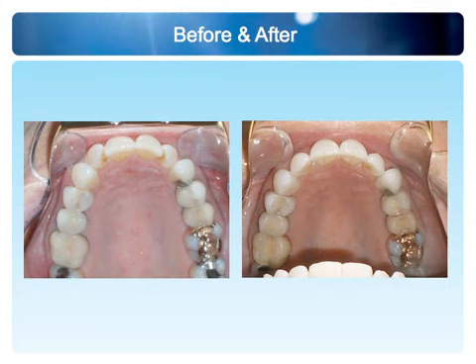The alveolar housing is still out there. We haven't caused any harm. By going wider, we still have a nice foundation out there. We can follow the cusps and the incisal edges all the way around. This case was treated without attachments on upper laterals. So that technique for me, without attachments there, has developed very nicely.